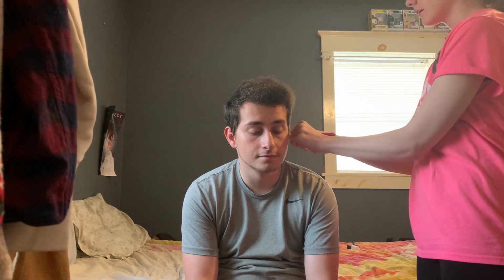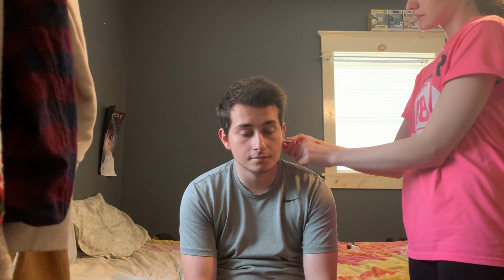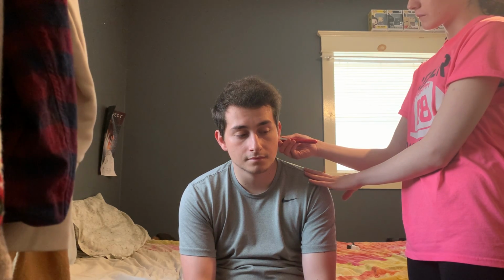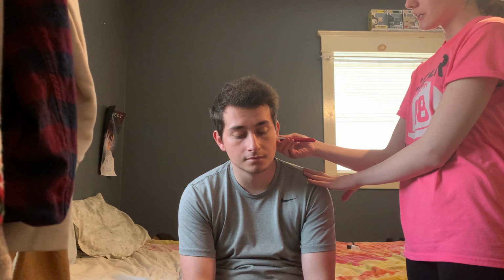And then there is the Rinne test, and this tests for conductive hearing loss or sensorineural loss. I'm going to say I have a tuning fork. I would bang a tuning fork off my knee, let it vibrate, and move it to the mastoid process right behind his ear. And this is bone vibration.